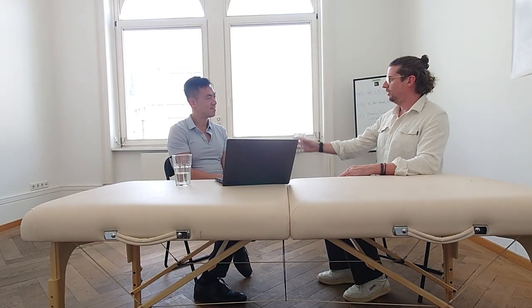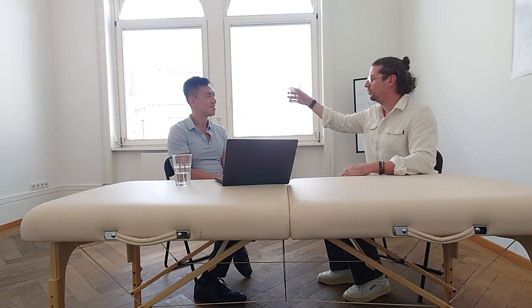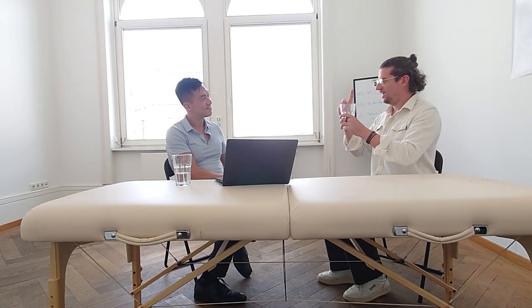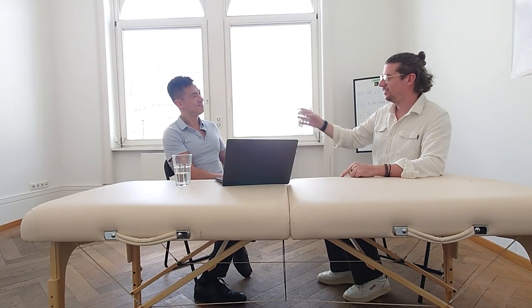If you have a really strong person, and I ask him to lift this glass, then he definitely can lift it with low activity. Okay, that's economic. If you have a really weak person, and I ask him to lift this glass, then he potentially creates a higher activity than the strong person in this specific task.